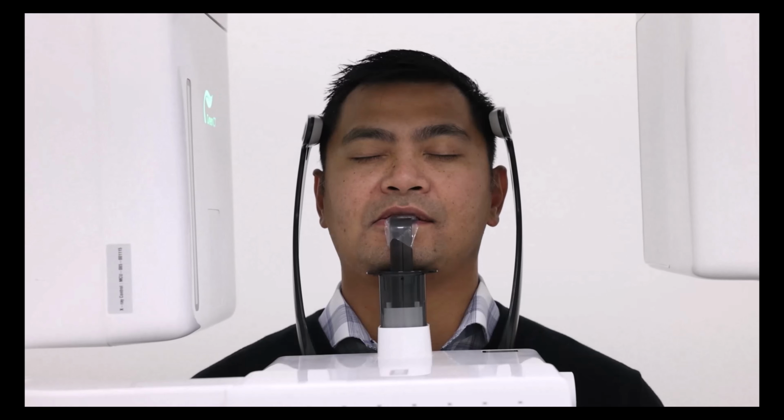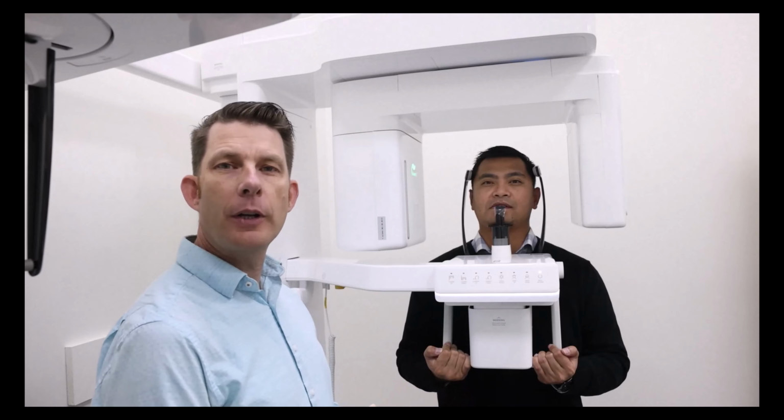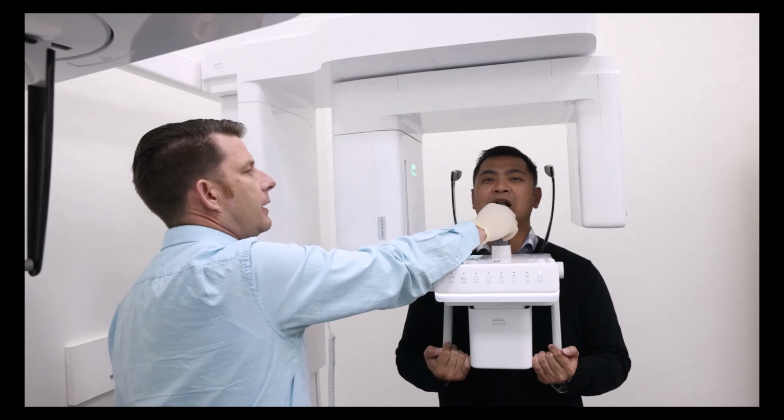Image capturing is complete. Please wait a moment. The scan is now complete. I'm going to go ahead and release the patient from the machine. You can go ahead and take a step back and out.